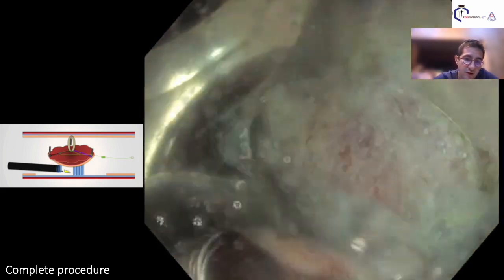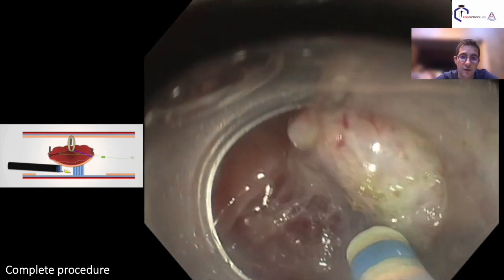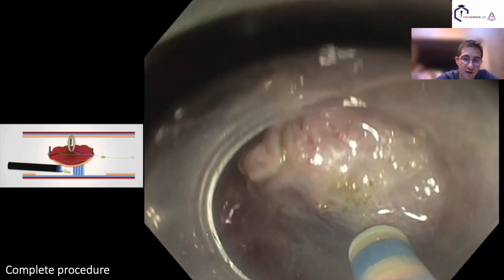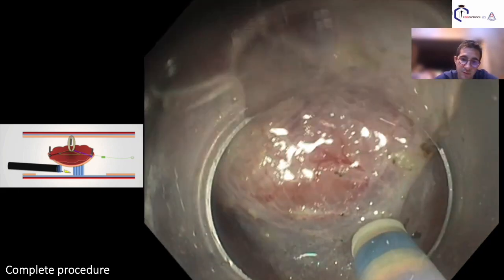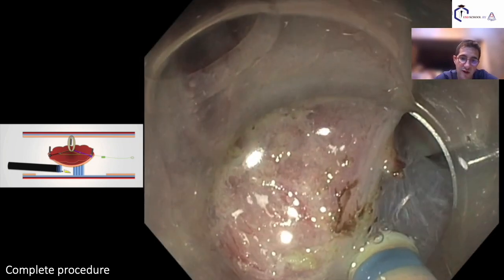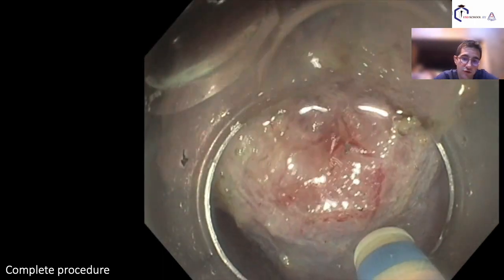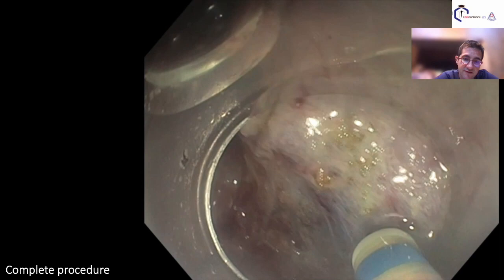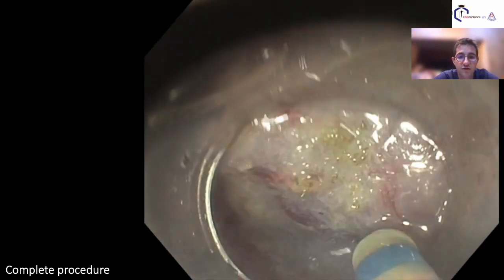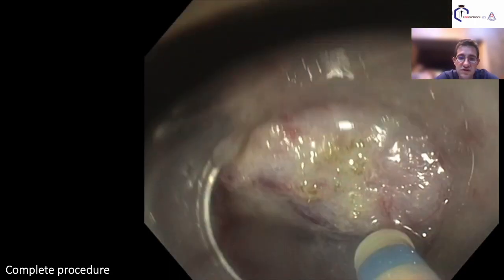and therefore every strike from the knife will cut more fibers because they are concentrated by the tension and by the force of traction to the opposite wall. So in fact you will increase a lot your speed because all the fibers are tightened, are stretched, and every cut will cut more, and therefore the surface will be cut in less duration, so in less minutes.